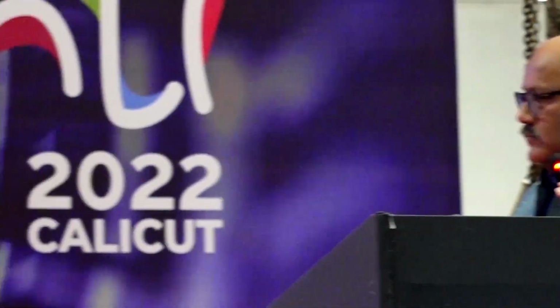Thank you, Arup sir, for that very illustrious presentation of managing a super hard cataract. Sir, I would just like to ask you, the mega tip which you showed, is it exclusive for use with the Geuder machine?